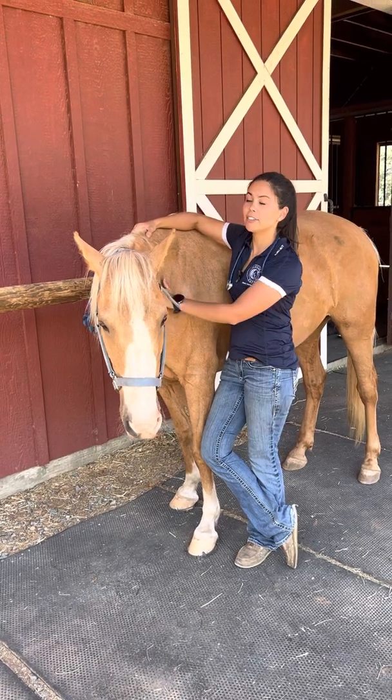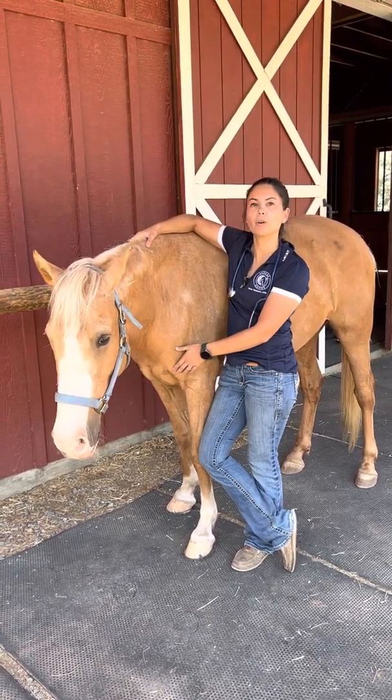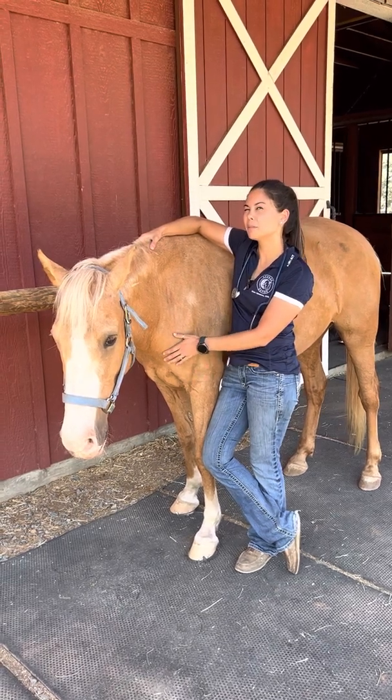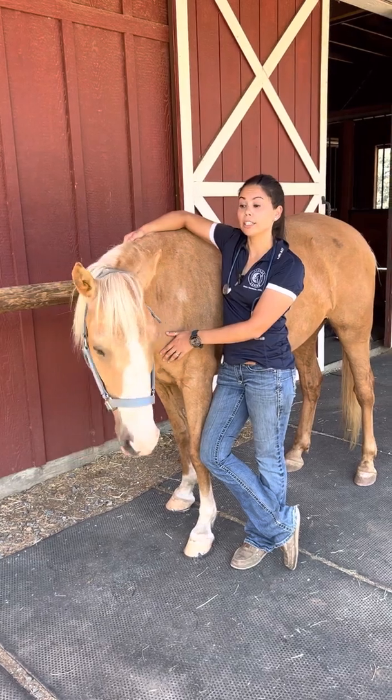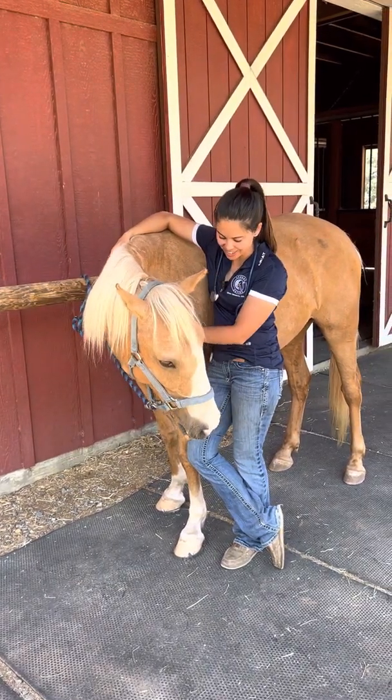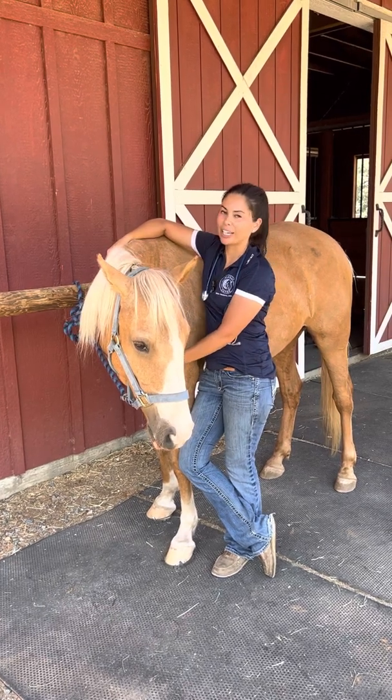That being said, if it's a really cool day out, if it's 60 degrees and perfect and they're at 101.3, I might think something might be going on. So always take your external environment into consideration as well. And then their respiratory rate should be between 10 and 20.